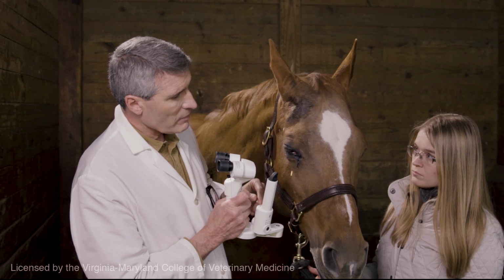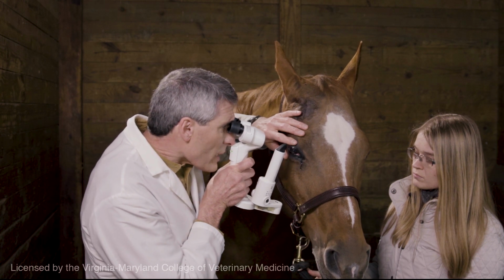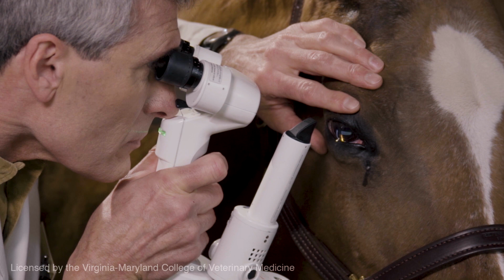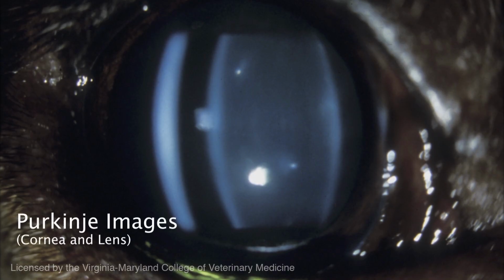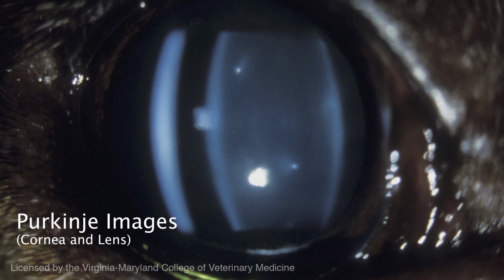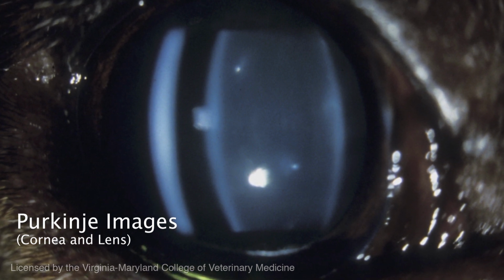I can make a small beam of light. And when I shine that into the eye, it's almost like I have a physiologic slice of the eyeball that I'm looking at. It's almost like taking the eye in the head and putting it under a microscope and looking at the section just like a pathologist would do.